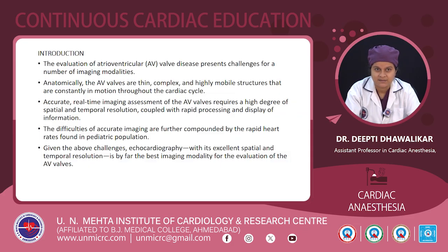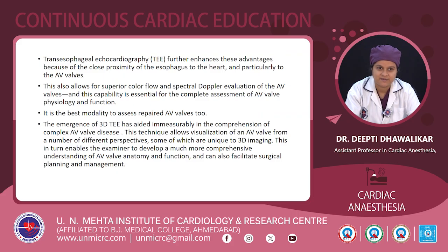the pediatric population. So given the above challenges, echocardiography, with its excellent spatial and temporal resolution, is by far the most useful imaging modality for evaluation of the AV valves.